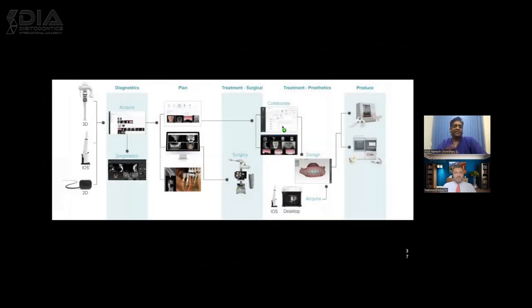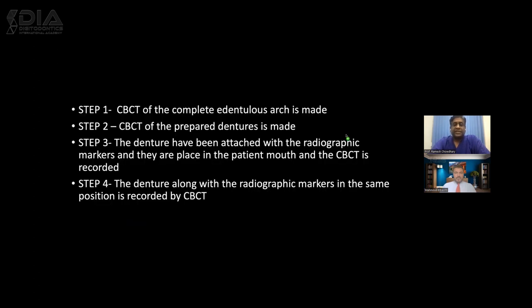Then came the full CBCT procedures, friends, which I should say was slightly revolutionizing for my work. This is the flow chart of that, where digitally you can get a CBCT scan, and of course, today we have intraoral scanning and synchronizing of both these data. Then it comes to the digital planning of the implant and even the restoration. Then you can get into treatment of prosthetic restorations, and then you can get the surgical guide and temporary restorations. So this is today's situation.